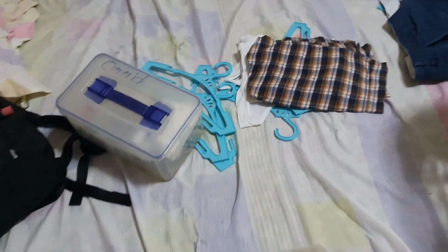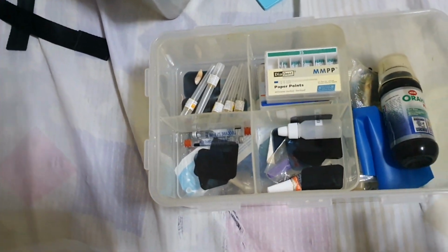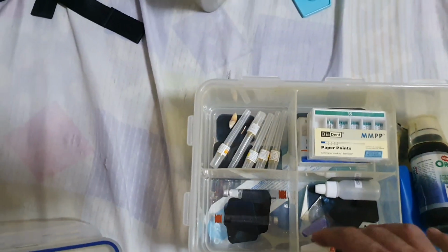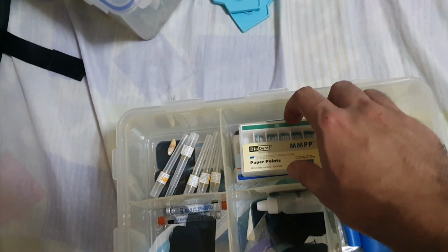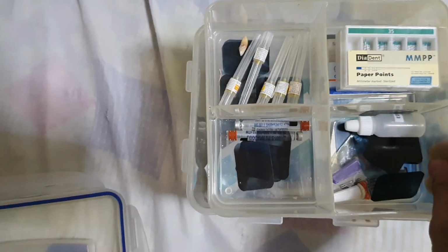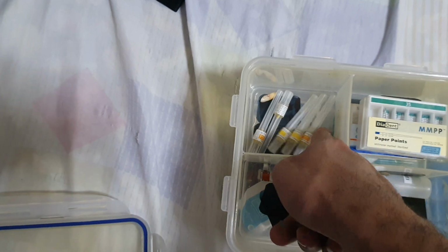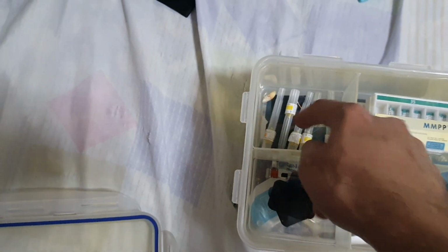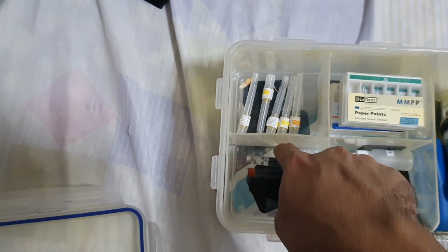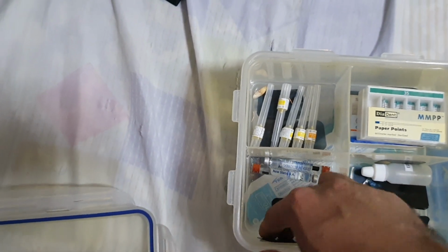So yeah, I think this is the future of my YouTube videos, to give you guys an educational tour about dentistry. So yeah, this is my endodontics stuff. As you can see here, this is for the needles, long and short needles, and then this is for the lidocaine.